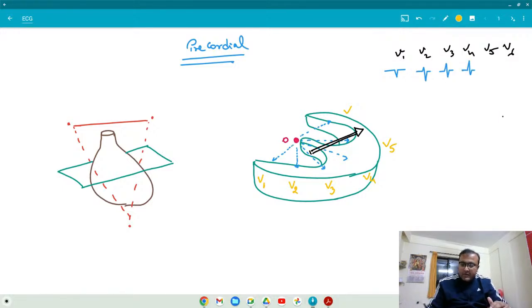So V5, you're at V5. So V5, what are you looking at? First head or first tail, or what is the situation? V5, train is going like this. Till now, you are seeing the head first and then a tiny bit of tail. But what is your take now?